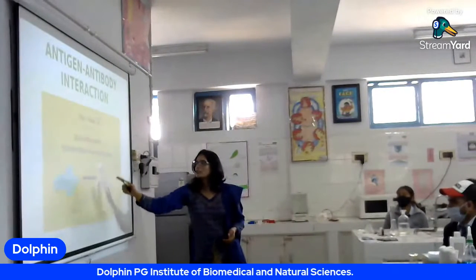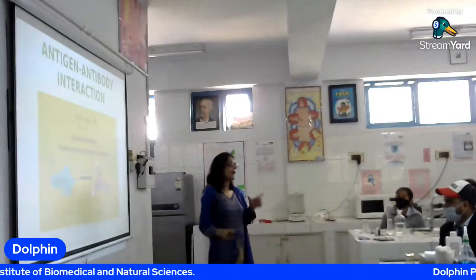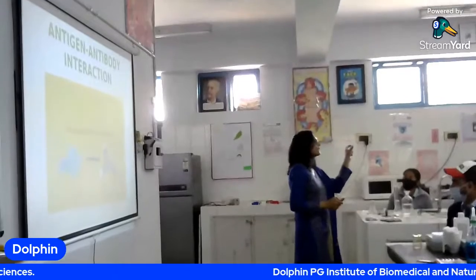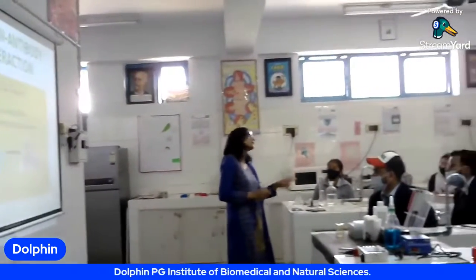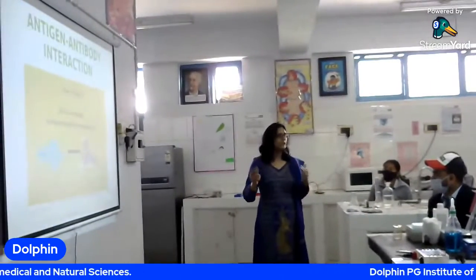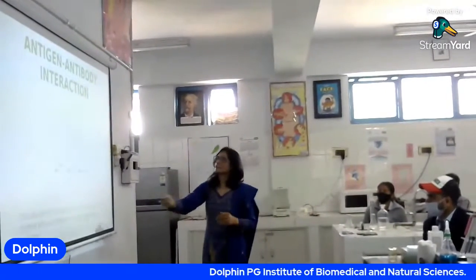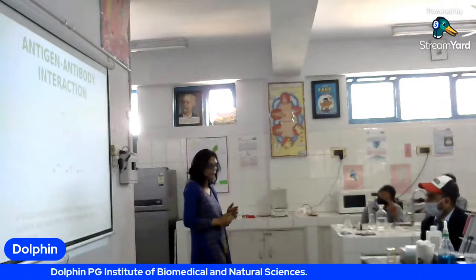That each antibody will bind with 2 antigen molecules. Okay. So the concentration should be such that both sides of the antibody are satisfied. What is its valency? 2 valency. All the valencies are satisfied so that the reaction can occur. So if there is more of either of the two, then the optimum reaction will not occur. So all this should point to this equivalence zone.